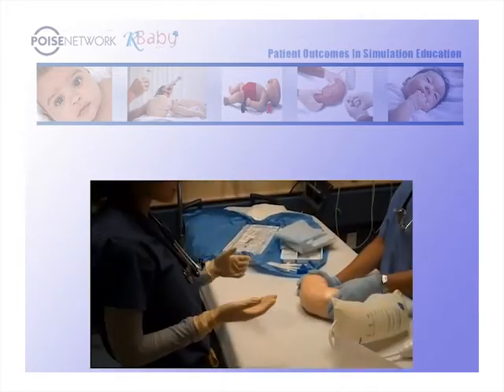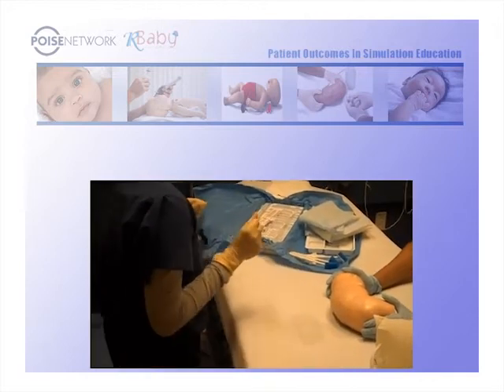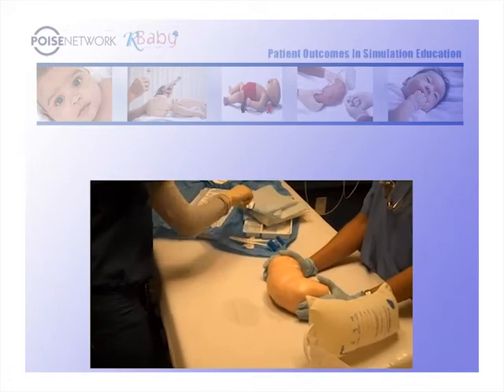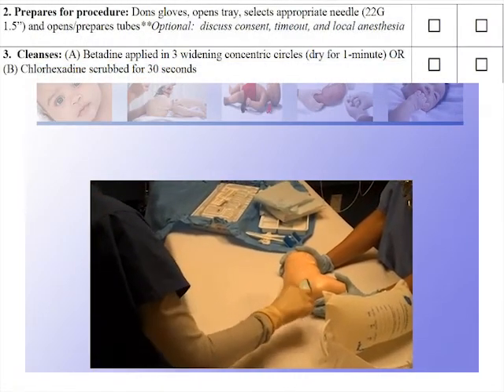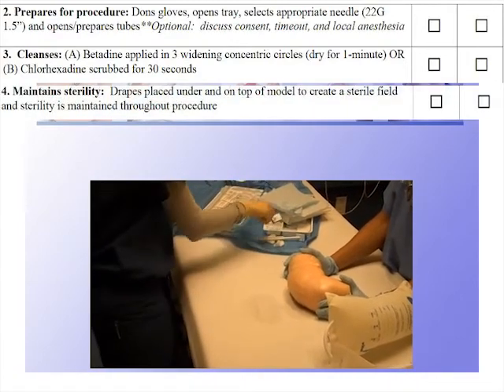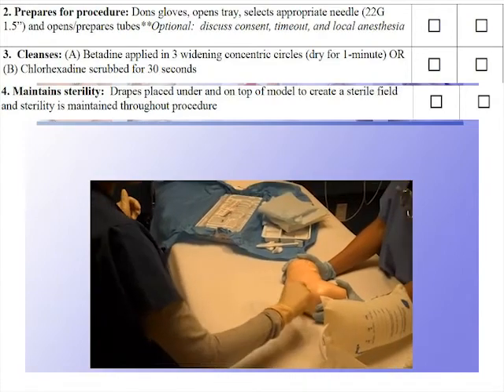Okay, so here's an example of another way. I wash my hands, I put my gloves on, and you can fill out the checklist for sterile gloves. I'm just going to clean off the baby to make as sterile a field as we can. Round circles, clean the top, so that part is sterile too. And I'm going to do this 3 times.